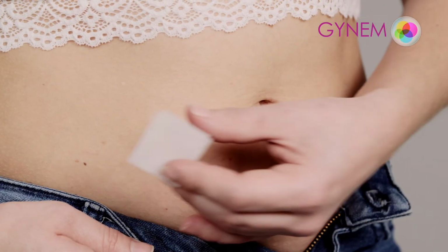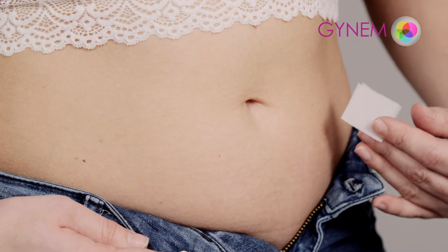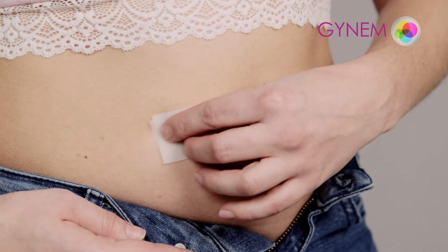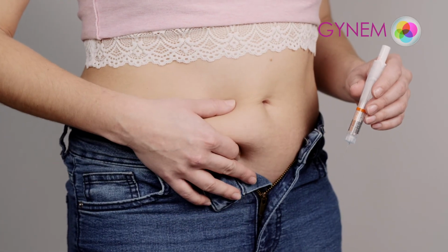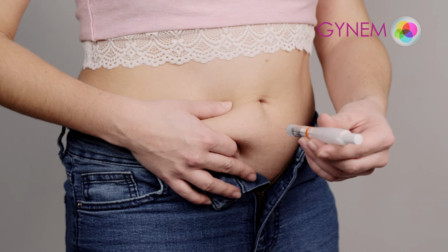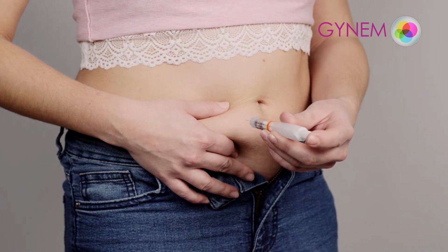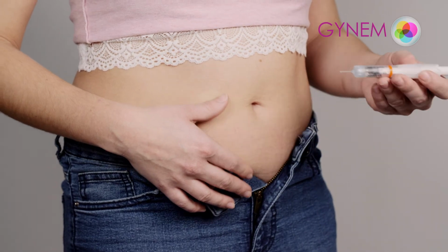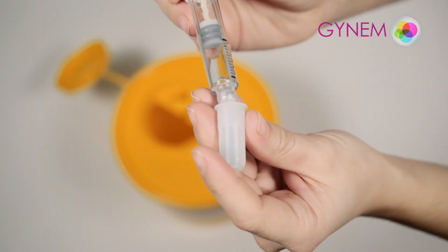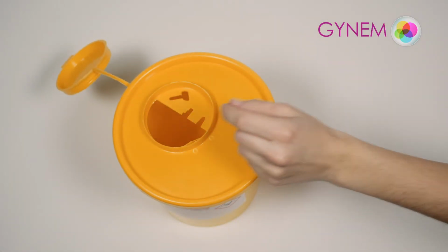For the injection, choose an area around the navel in the lower abdomen and change the site of the application every day. Use a disinfectant pad at the chosen area. The drug should be administered subcutaneously, therefore the injection should be performed at an angle of 90 degrees while holding the subcutaneous tissue. Insert the whole needle into the subcutaneous tissue and apply the medicine by squeezing the side of the pen. Dispose of the needle in a container and use a new needle every day.